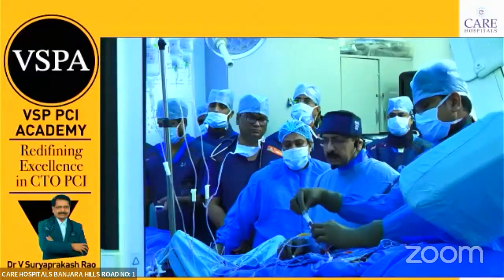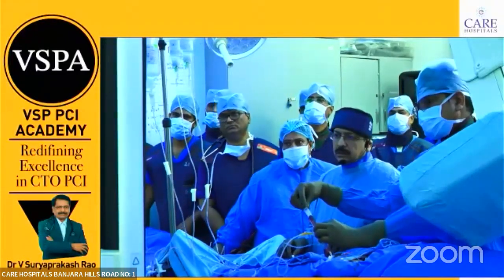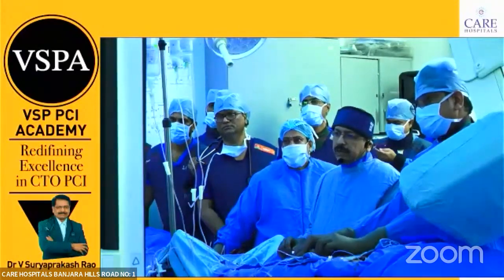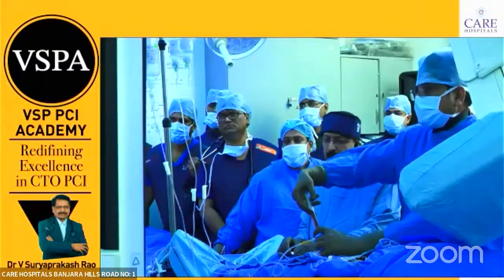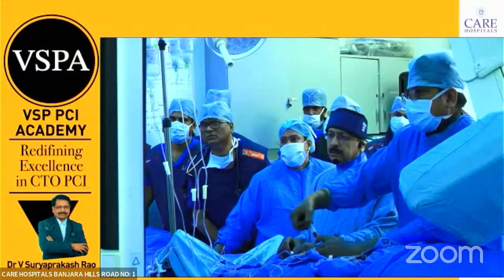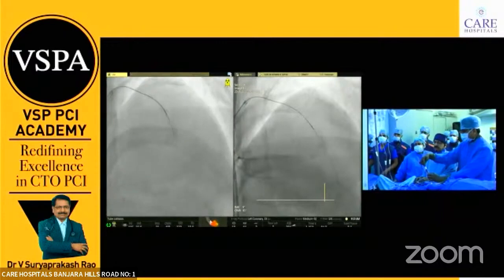Just one minute. Okay. You again give a good injection. Okay. Now it is in the branch. Okay. It is in the septal. You can give here.